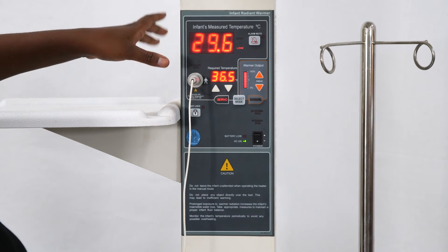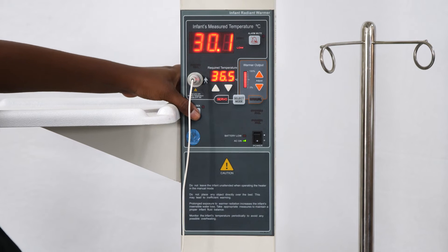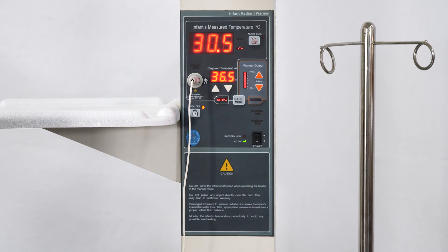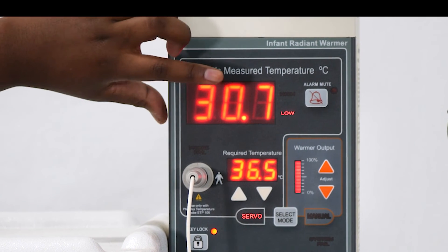Once you have set your target temperature, you need to lock it so that it cannot be altered accidentally. The largest numbers at the top show the temperature measurement coming from the probe. So as long as your probe is attached properly, this shows the baby's temperature.